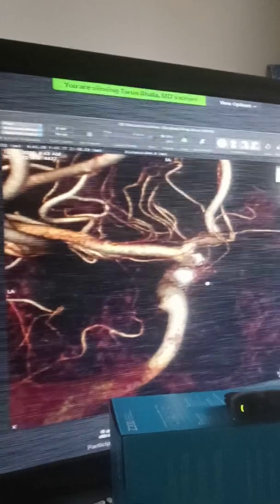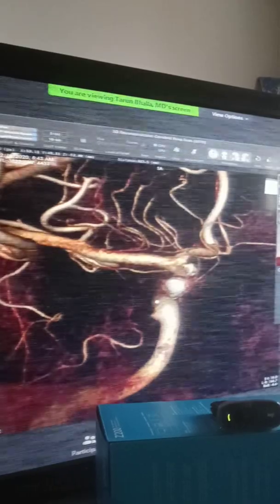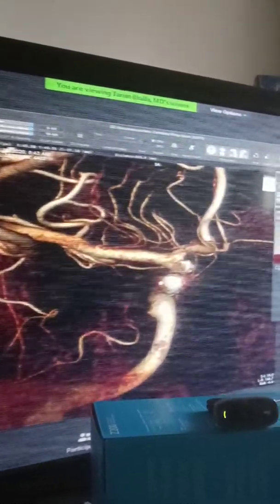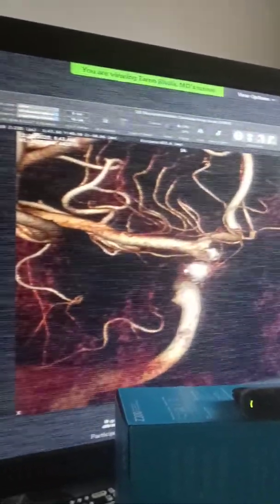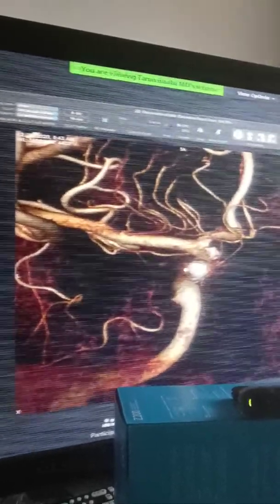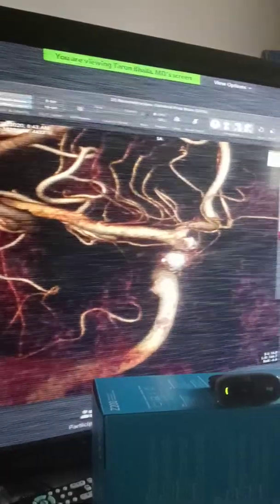Given the location of this and the other aneurysm that would also need to be looked at, given that there's 2 in that same area, I can't treat both of those with a stent. And even if we were to treat this one, the other one, in my opinion, would still be left untreated with a stent. And there's really no more room for us to put any more coils in. So what we're left with based on those modalities is to treat it from outside the blood vessel, which is with a craniotomy for clipping of the aneurysm.